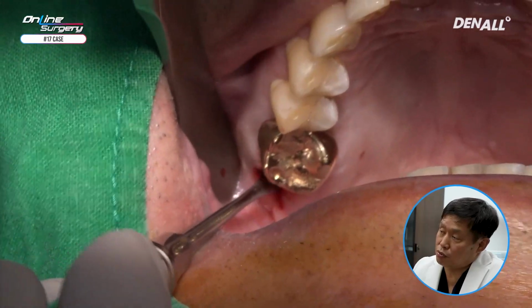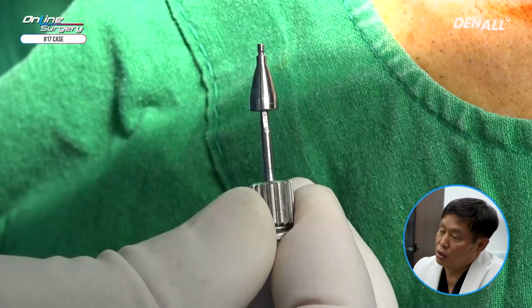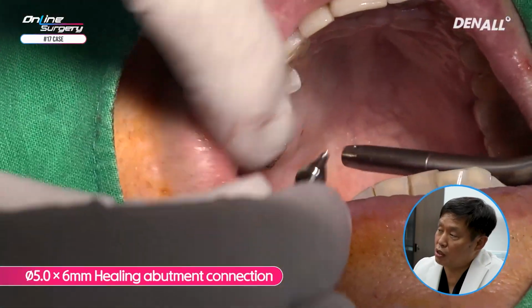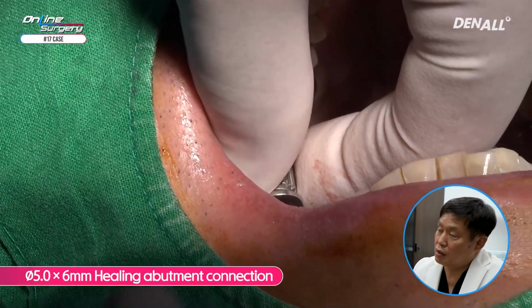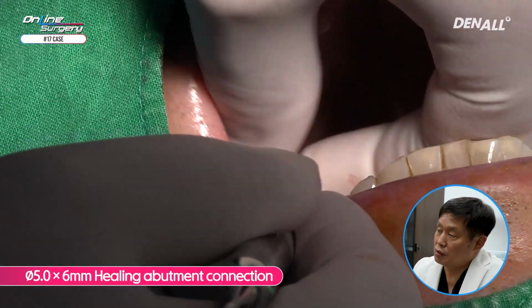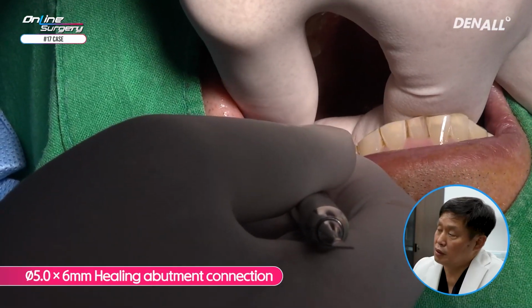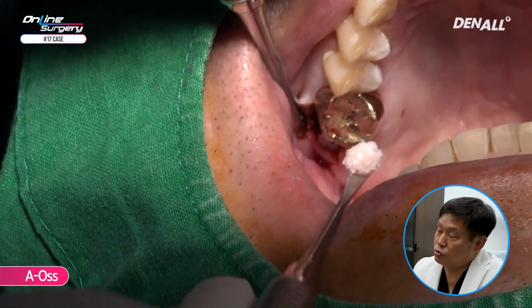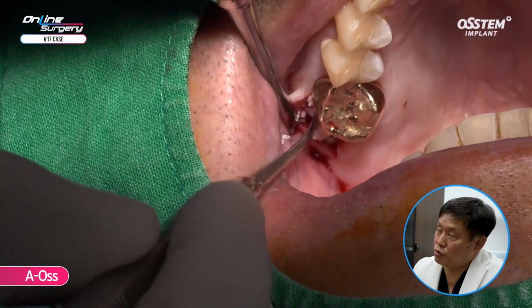After flap reflection, before doing bone graft, in order to make sure that it does not go inside the implant, the healing abutment should be connected first. 5.0 by 6 millimeter healing abutment was connected. After that, on the buccal side, because there is area where there is lack of bone formation, AOS particle bone was used.